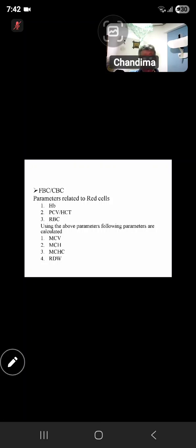The time differs with the method that we use. If it is a microhematocrit method, only 5 minutes is used as the centrifugation time. If you are using the other technique, we have to centrifuge the sample about 30 minutes. So when we are estimating it manually, we name it packed cell volume, right? But in the automated analyzer, it is named hematocrit or the HCT.